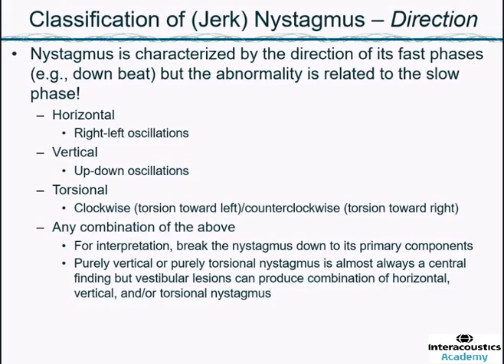When you talk about clockwise or counterclockwise, that changes. Clockwise, counterclockwise is based on the examiner's point of view. So it's you looking at the patient's eyes to see which direction it's moving. To eliminate that inconsistency, if you say torsion toward the left or torsion toward the right, again, you're talking about the patient's point of view.